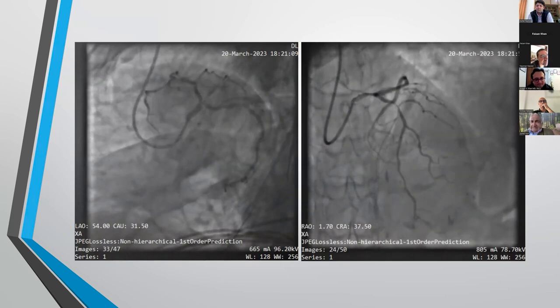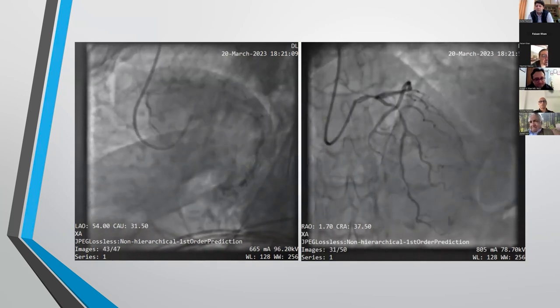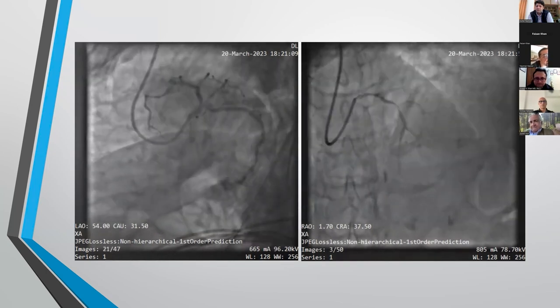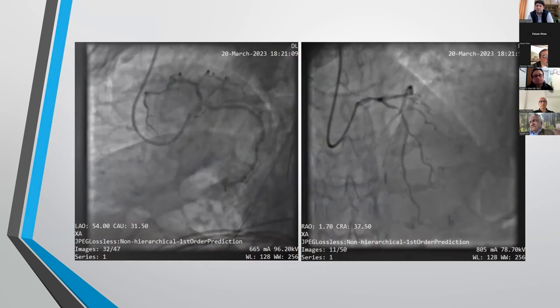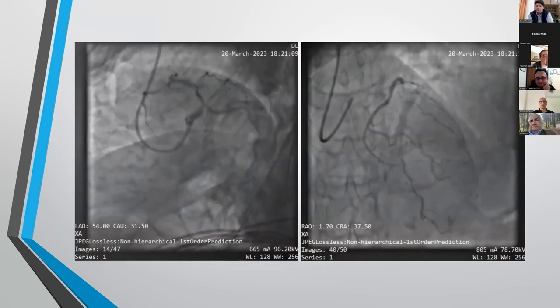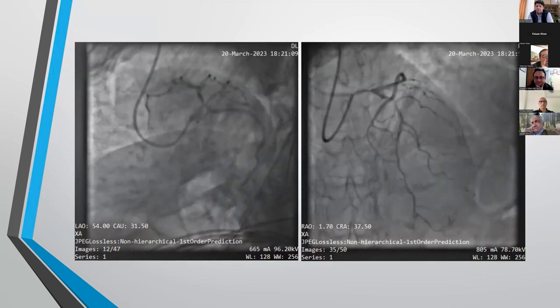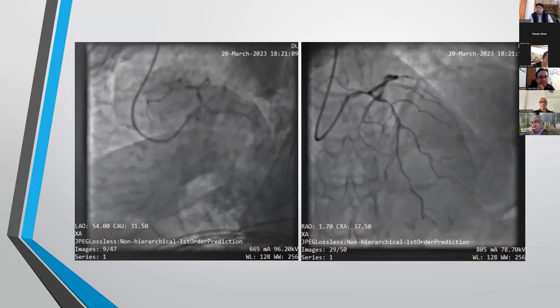Valid points. If you're committing to left main, and if I was going to do left main PCI, I would go with IVUS, no doubt. But if you're not sure whether to do that left main or not, I would want to use physiology along with it as well. Because committing to a left main, unless the MLA is more than 6 millimeters square, you can safely defer. But otherwise, use physiology as well, combined with it.